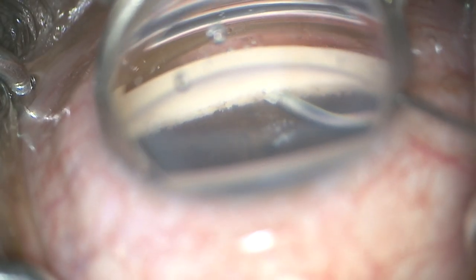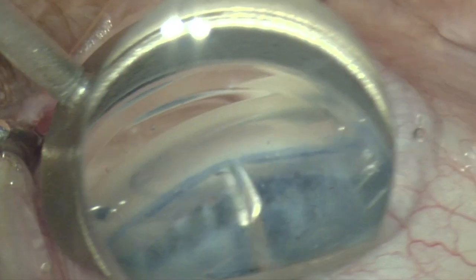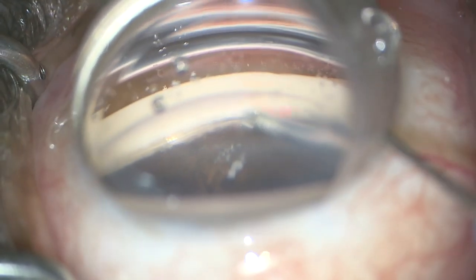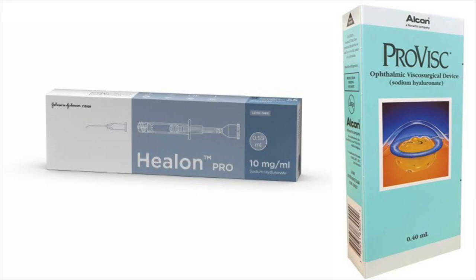Trypan blue can be used to stain the TM, which can be particularly useful in eyes with very lightly pigmented TMs. The spatulated tip of the cannula can be used to make the otomy to start the procedure, or this can be done separately with a Sinskey hook or MVR blade, for example. The canaloplasty can be done as the catheter is advanced around Schlemm's canal or when it is being retracted back out. We recommend using Healon Pro in the catheter, but Provisc can also be used.